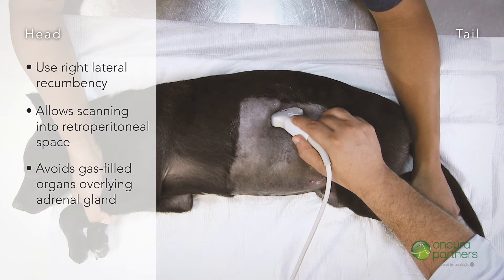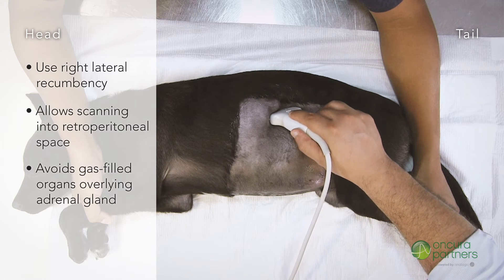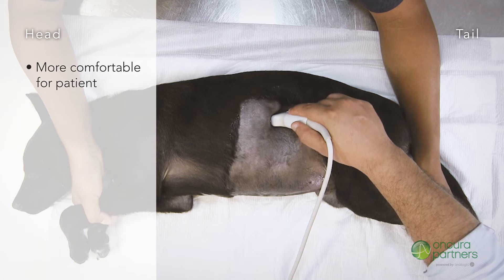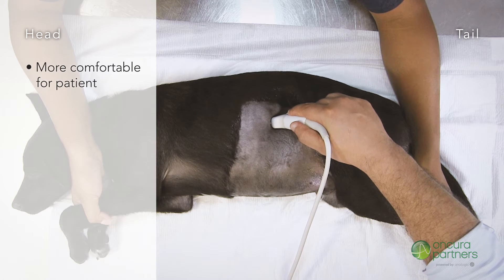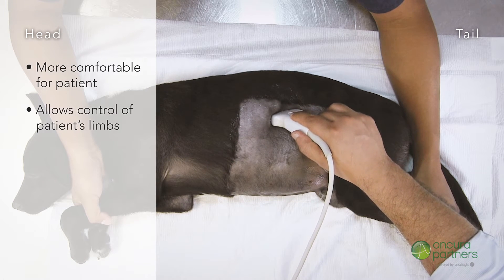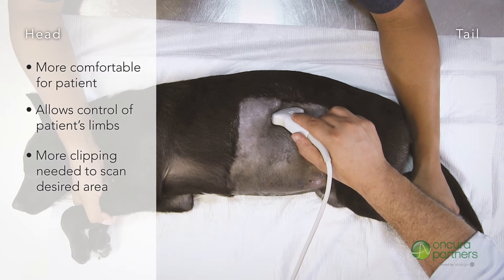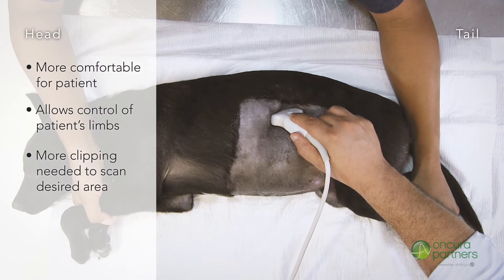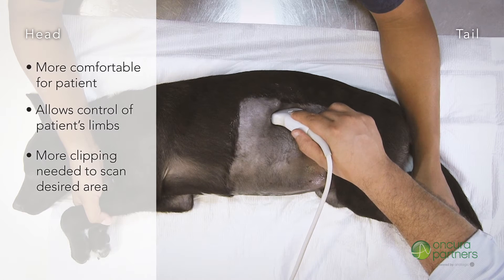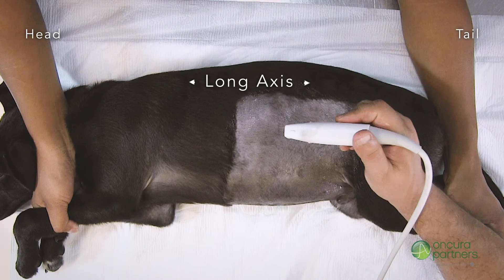Thirdly, this position seems to be more comfortable for patients and only requires one person to hold the dog. It should be noted, however, that more clipping will be needed to reach the desired area — something to consider when speaking to pet owners.